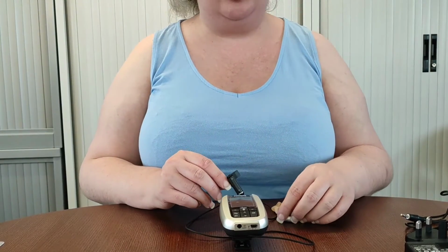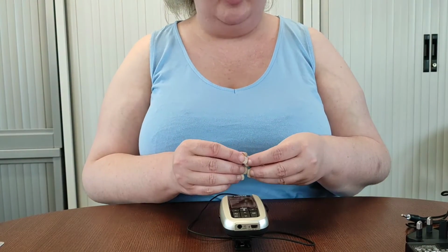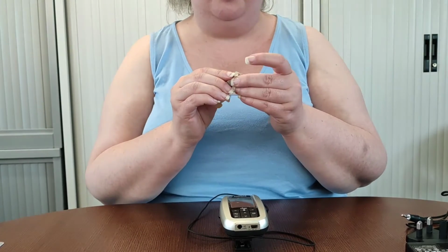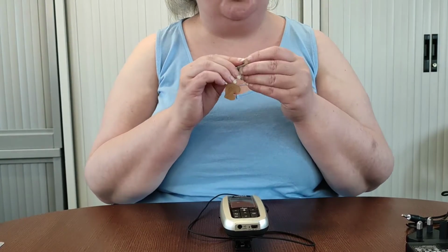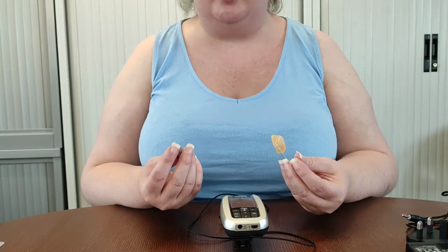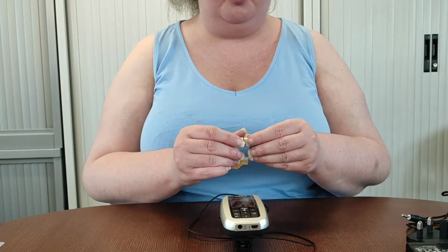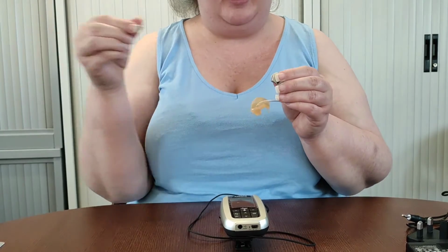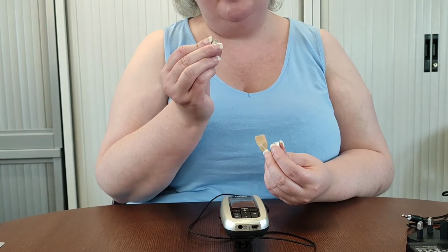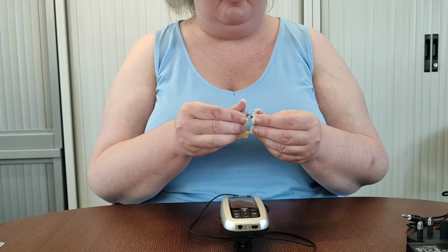So if we find that it's not connecting, we have several very simple troubleshooting steps that you can follow. Firstly, you can check that this audio shoe did actually slide onto your hearing aid and clip and is flush with it. That's a common problem where it hasn't quite clipped on. It could be a matter of a millimetre, but it really makes a lot of difference in whether it will connect or not. The next thing would be, again, you can make sure that your receiver has clipped in and is flush. And also you could just check it visually to see if there's any dirt or anything that might be obscuring that connection, and giving it a quick brush over if there is.